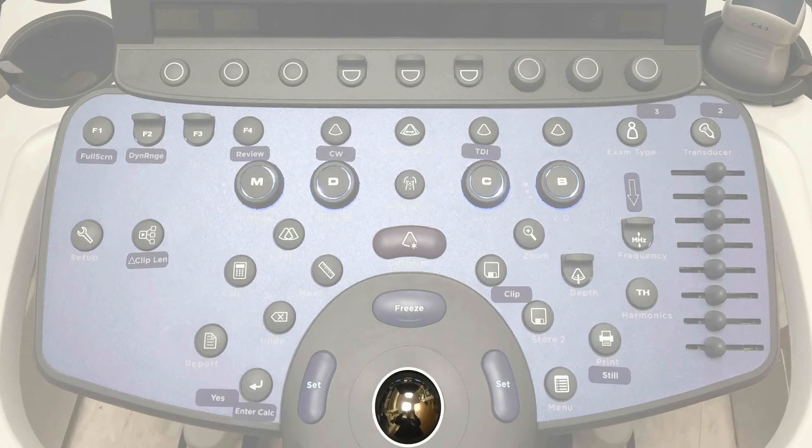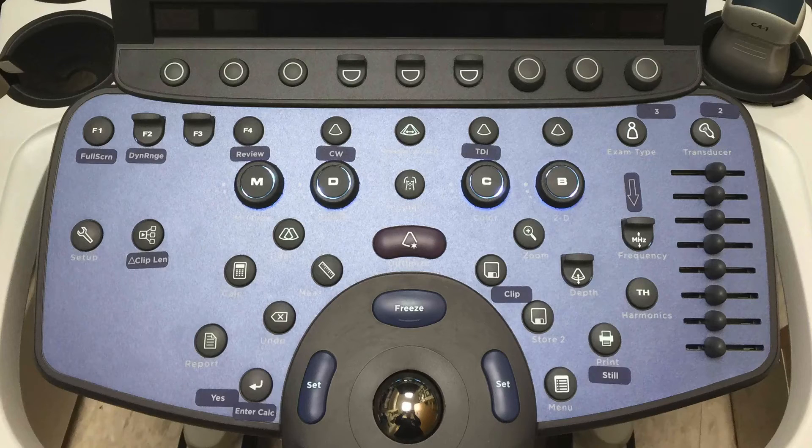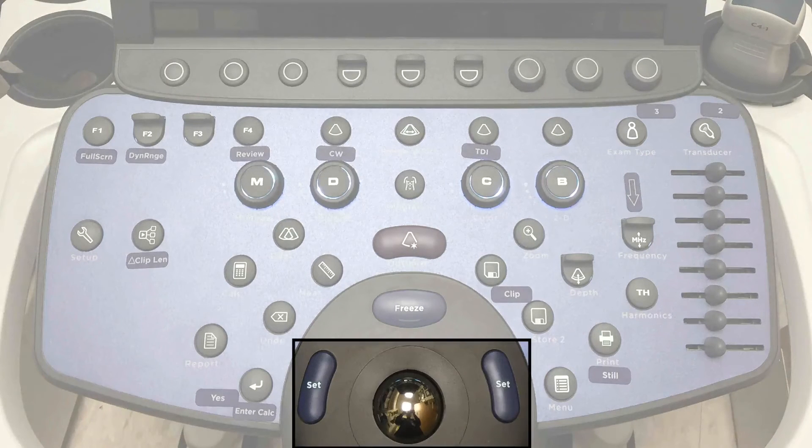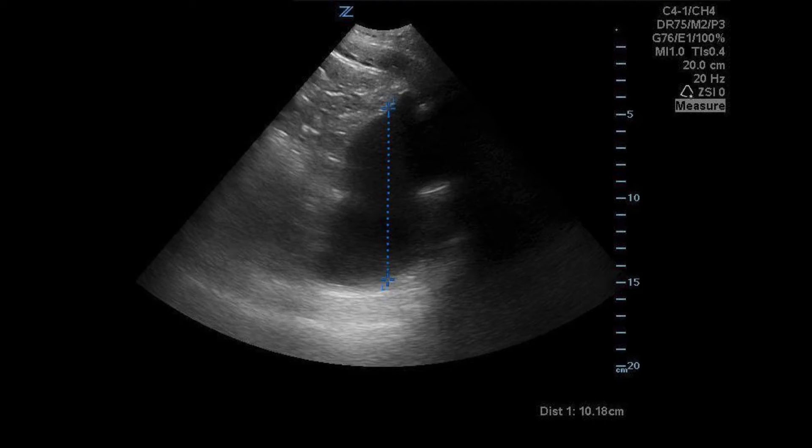You can scroll backwards and forwards through the cine loop to find the optimal still image to save. To scroll, use the trackball to move forward or backwards in the cine loop, then find the image you want and store it. To measure, click the measure button — the ruler — and use the trackball and set key to adjust your caliper. When you first press the measure key it will default to distance.